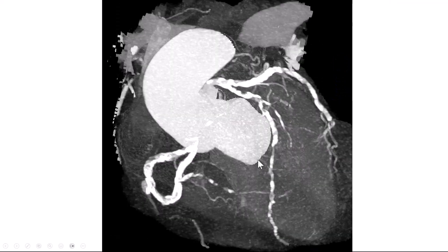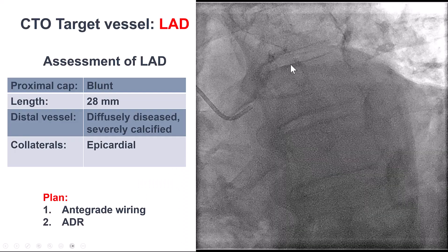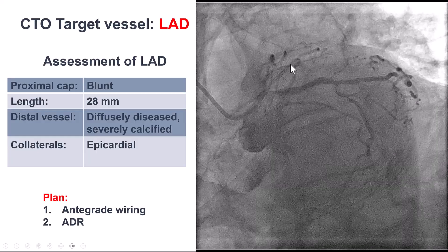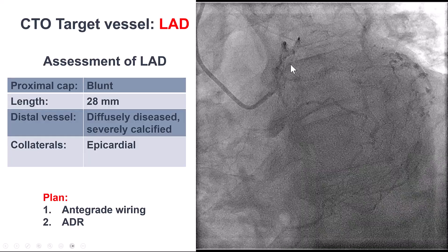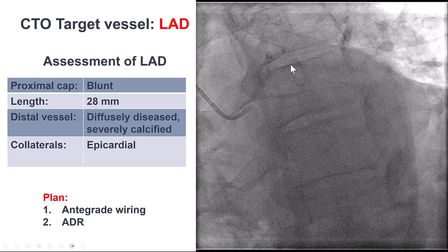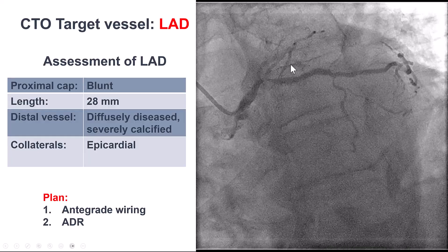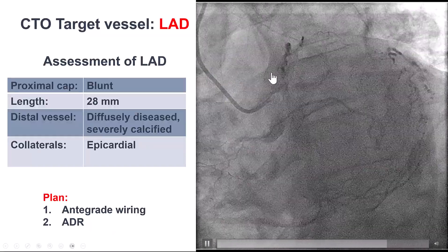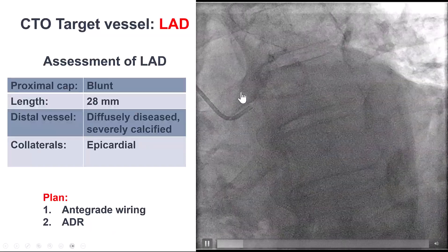The areas of blue represent calcium. The distal cap is shown in green and the proximal cap in red — significant calcium through the occlusion and at both caps. This is the MIP, or maximum intensity projection, showing heavy calcification of the proximal LAD as well as the mid and distal, essentially in all coronary vessels. The patient was referred for PCI.